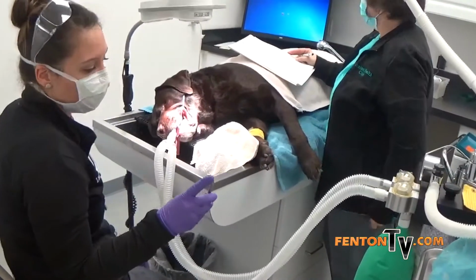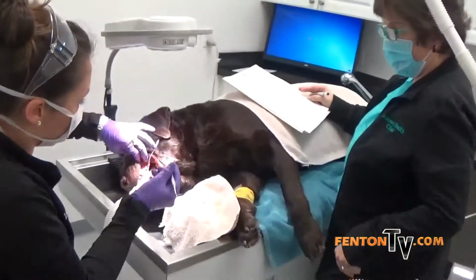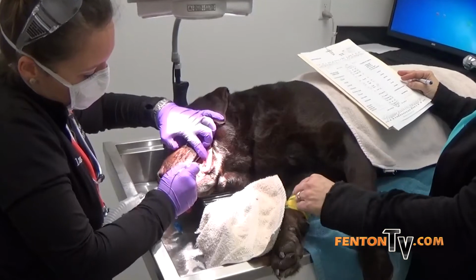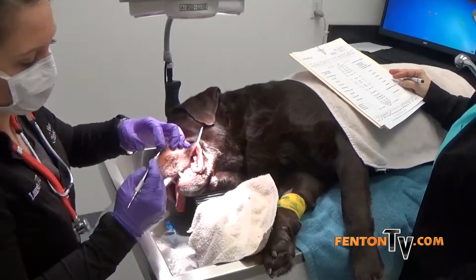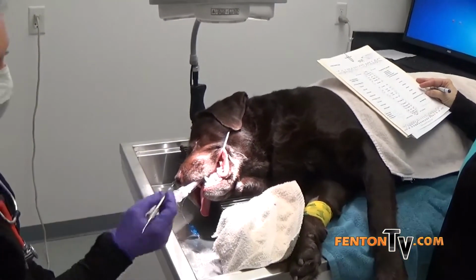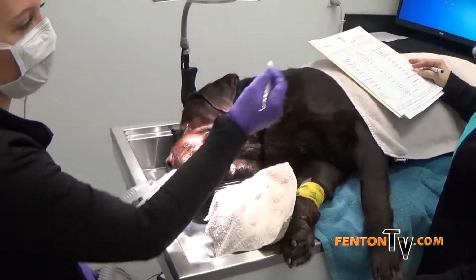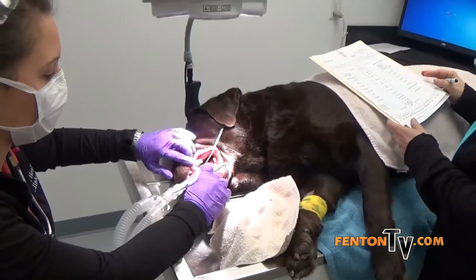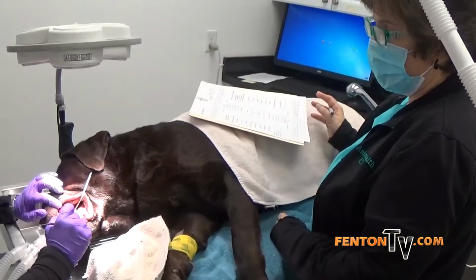And we check their pocketing, which means their gingival pocketing. So I can get this under the gums a certain distance on this tool, and then we put it there. And if there's anything concerning or a really deep pocket, then we will take a radiograph of that too.